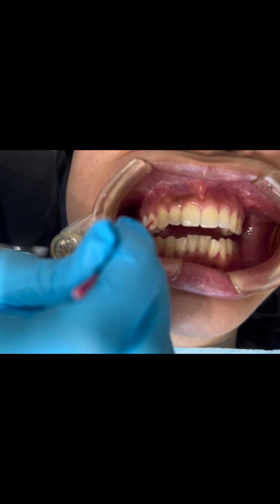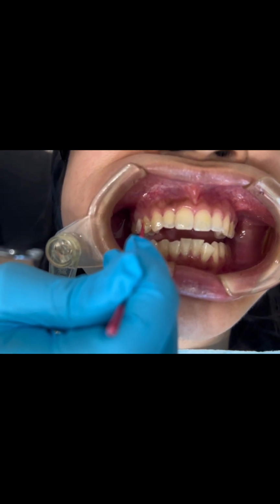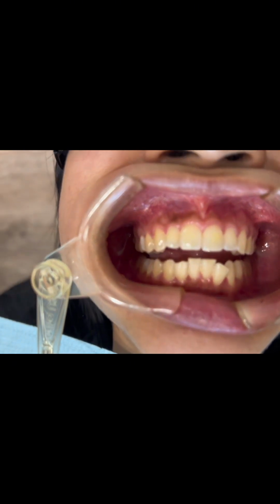We're gonna do premolar to premolar because that's what the doctor asked for. Okay, we always do what the doctor asks for. And we prep the tooth. Just make sure that everything's nice and juiced up.